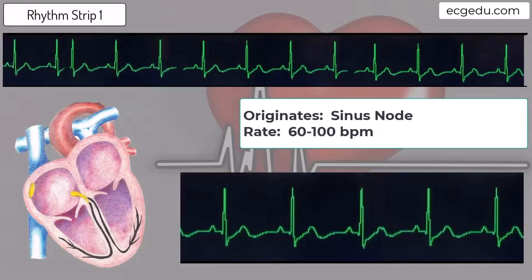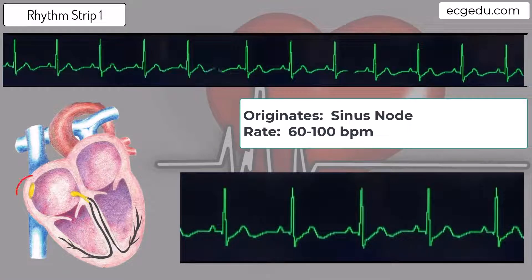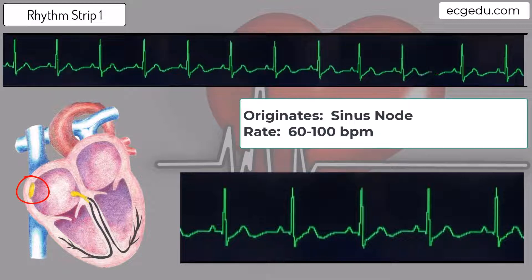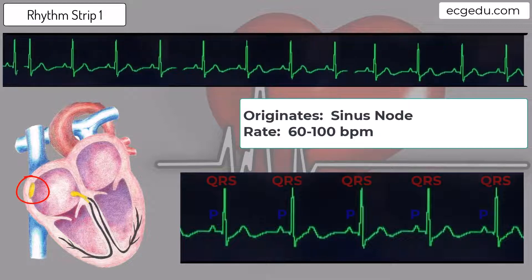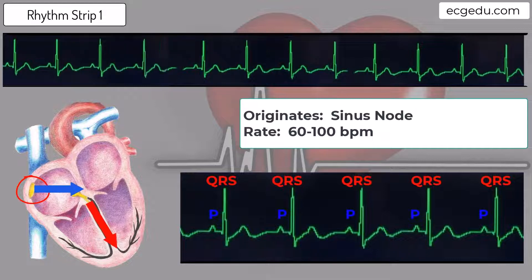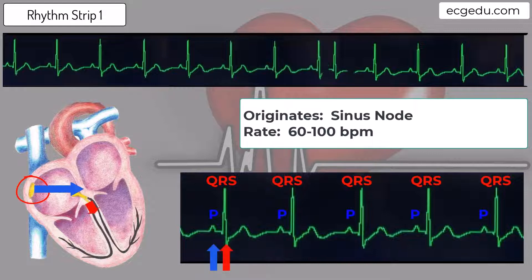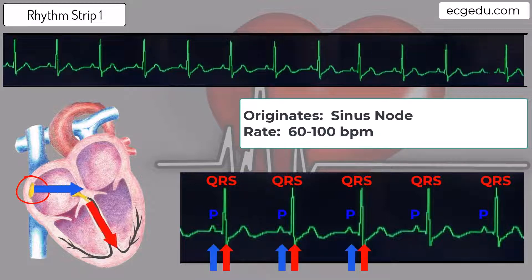This rhythm is Normal Sinus Rhythm. Normal Sinus Rhythm originates from the sinus node and beats at a rate between 60 and 100 beats per minute. There are regular P-waves followed by normal, narrow QRS complexes — PQRS, PQRS, PQRS, and so on.